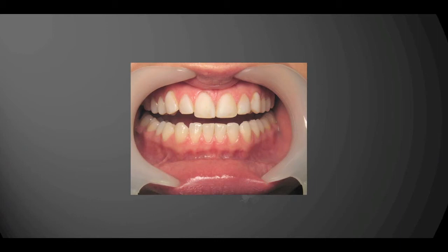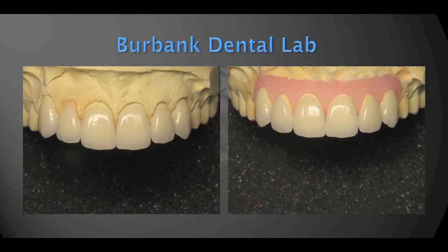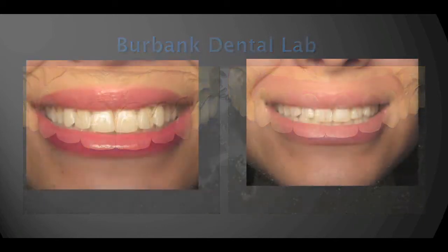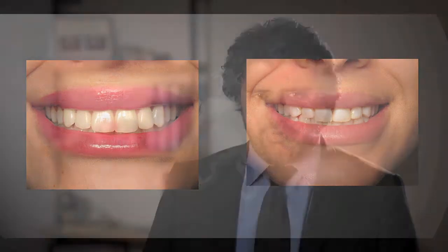This is a case of a patient who had a traditional situation where the color of her teeth was not very good and she had some bondings that were not very satisfactory. You can see a minimally invasive approach to preparation — very little tooth was taken off — and great laboratory work. We all know that when we do porcelain veneers, the ultimate result the patient can see is not really our work but the laboratory's work. I've been working with Burbank Dental Lab, and you can see the results are very satisfactory — beautiful — and the patient was very satisfied. This is a traditional case where we're essentially coating the front of the teeth with beautiful porcelain.